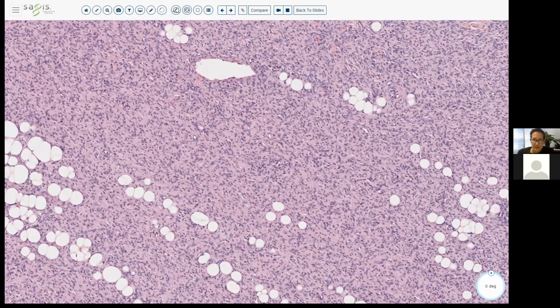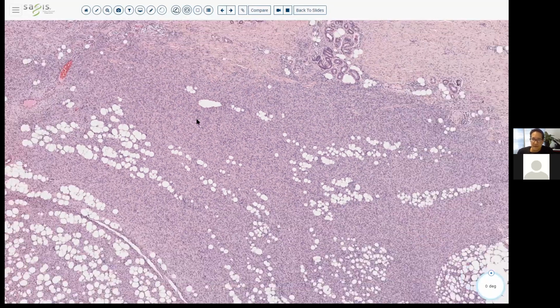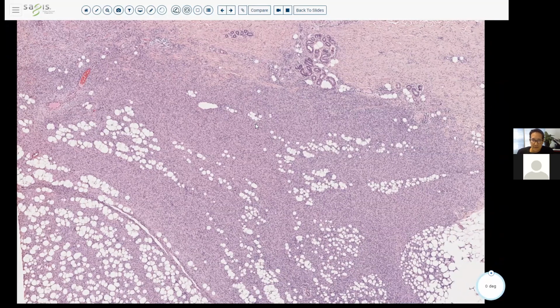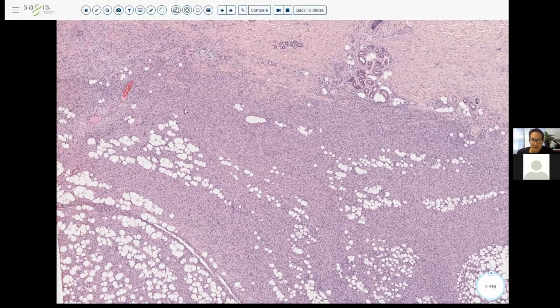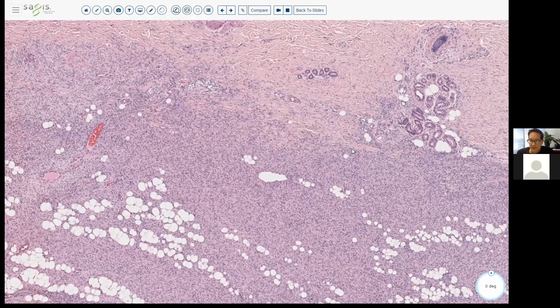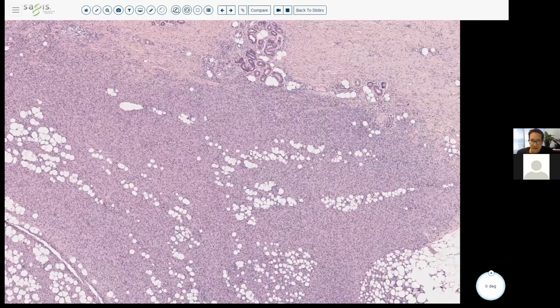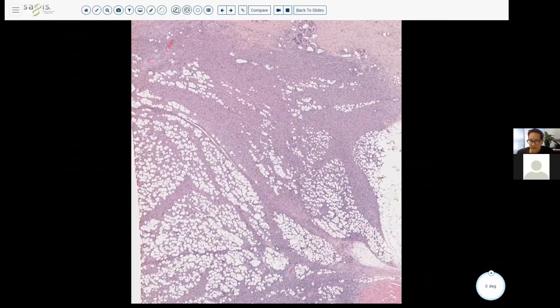That's one of the clues, and it's actually the monomorphic nature of the infiltrate that clues you into DFSP versus a dermatofibroma, where the cells have quite a bit of variation in size. Notice this one does, at the edges, wrap around collagen bundles as well, okay? They are somewhat related to DFs, but in this case, they are going deep into the fat.